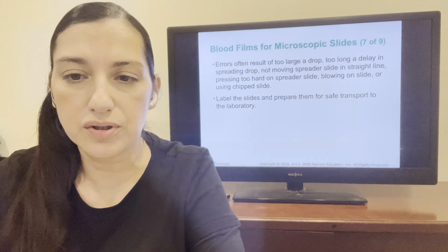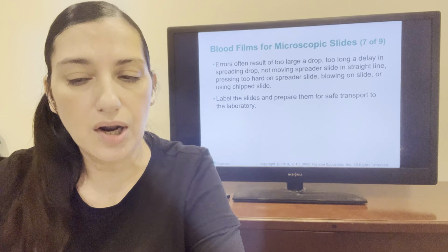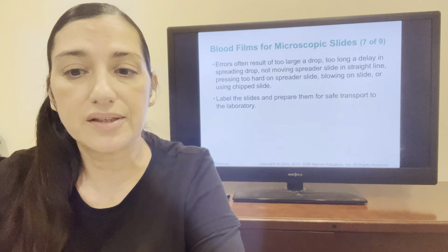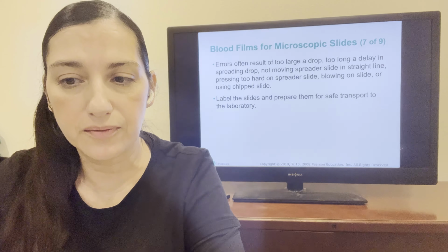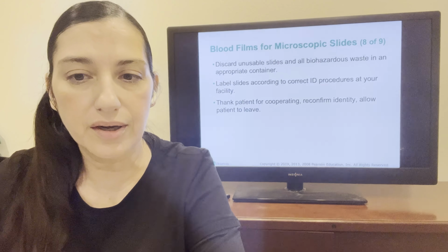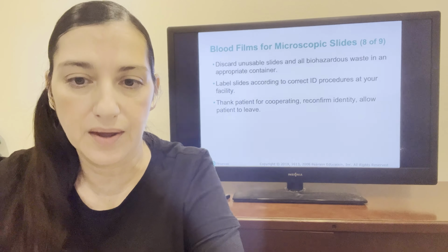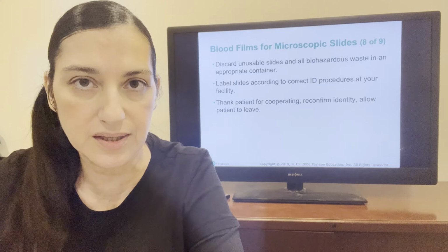Errors often result from too large of a drop, too long of a delay in spreading the drop, not moving the spreader slide in a straight line, pressing too hard on the spreader slide, blowing on the slide, or using a chipped slide. Label the slides and prepare them for safe transport to the laboratory. Discard unusable slides and all biohazard waste in an appropriate container. Label the slides according to correct ID procedures at your facility.